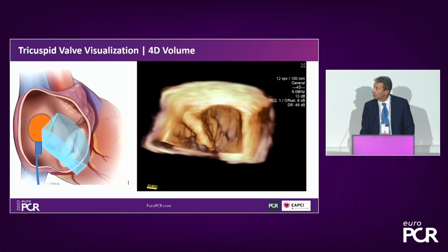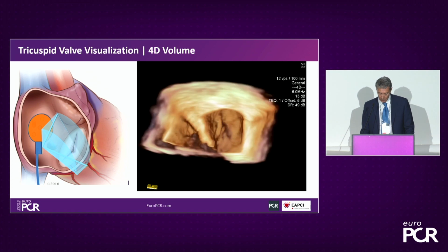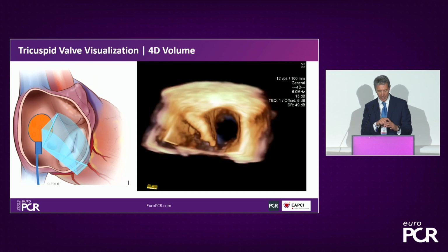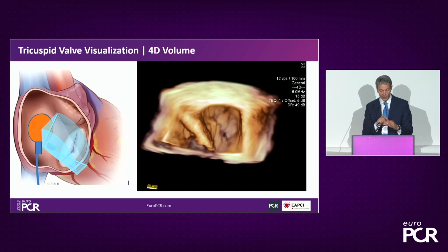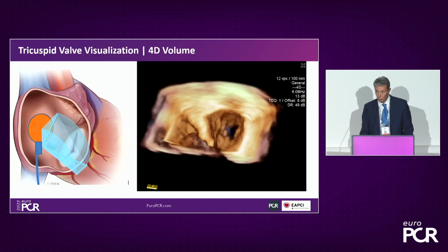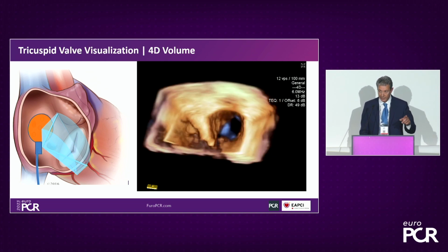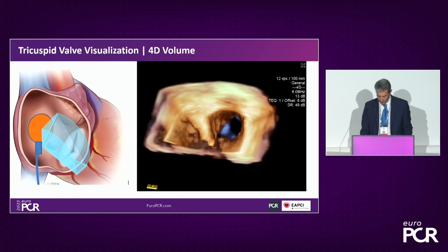I start from the slides that you showed before. Cardioband is a very complex procedure because it requires anchoring 15, 17 anchors along the annulus in a precise position, but not only in a precise position, but also with a precise orientation. So we need a clear visualization of the anchors, of the leaflets, of the hinge point. Usually we start from this view to approach the first anchors toward the aortic valve, and then we move in a clockwise direction from the anteroseptal to the posteroseptal commissure.